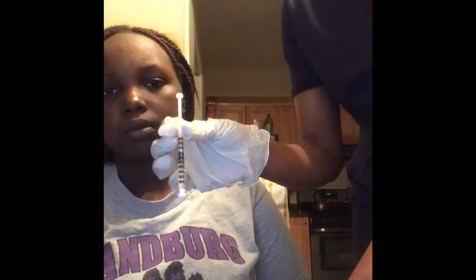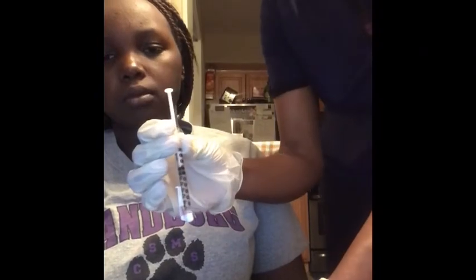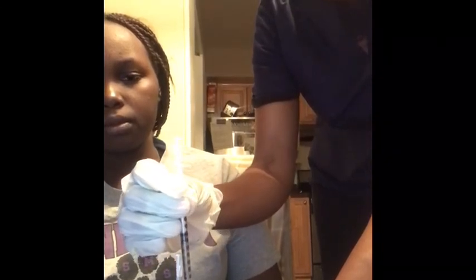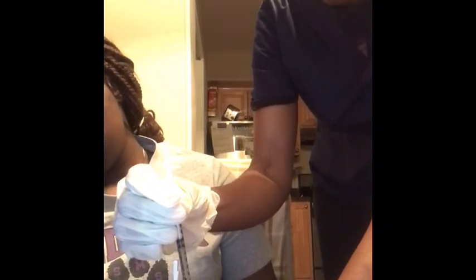And then I'm going to get my injection, and then I'm going to remove the cap. I'm going to be giving it at a 90-degree angle. I'm going to pinch the skin, and then put the needle directly into the skin, straight at a 90-degree angle.